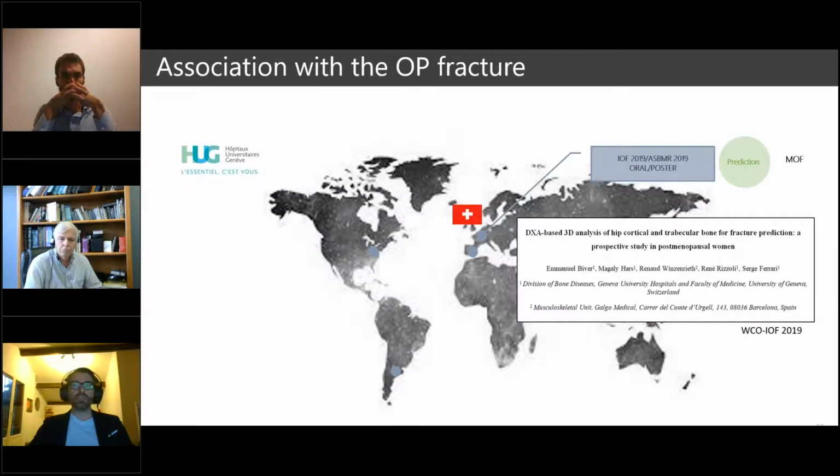Regarding the fracture prediction, the first study that has been done investigated the capability of our 3D measurement to predict the fracture. The study was done in Geneva by Dr. Beaver and focused on the prediction of major osteoporotic fracture.